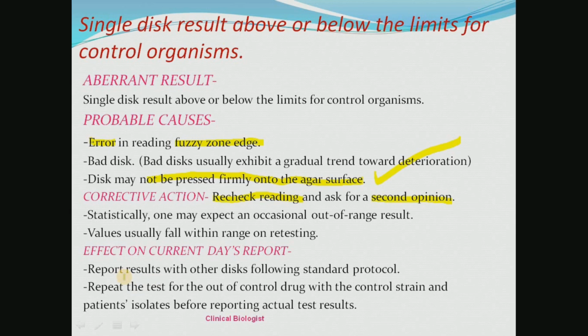Once the corrective action has been done for this problem, only then report the result of that disc. But in the meantime, you don't have to hold all the other antibiotic results.